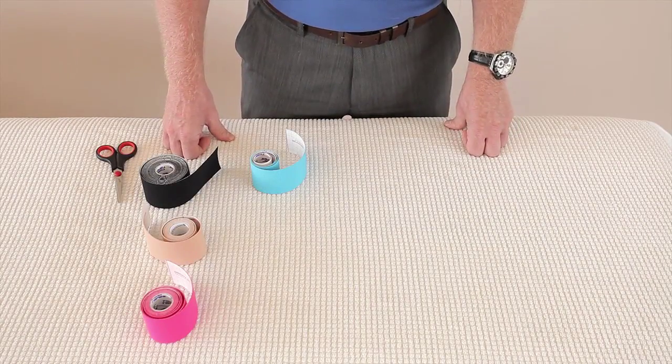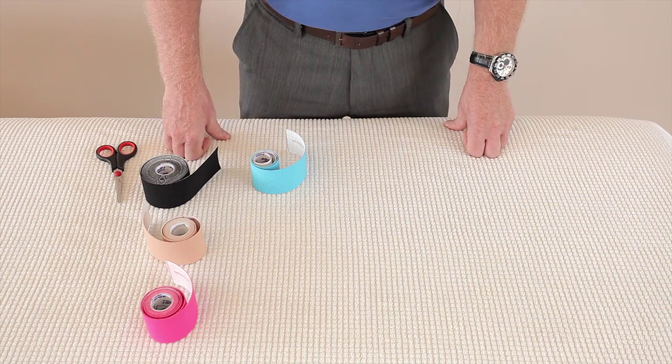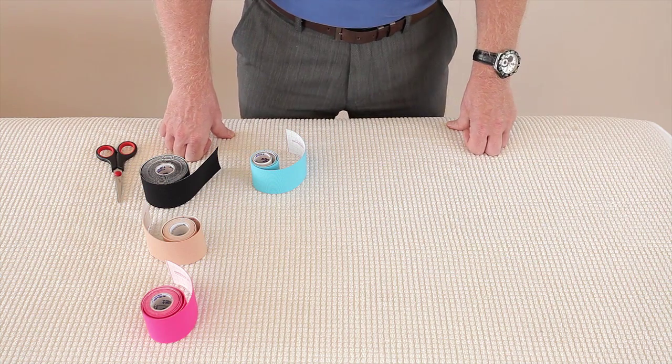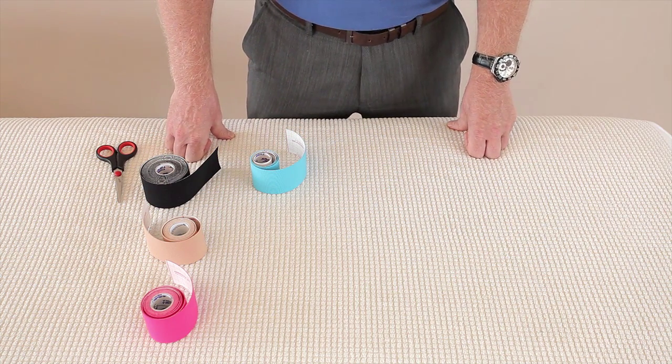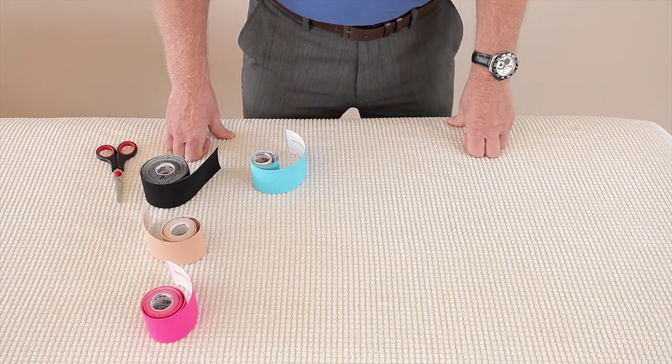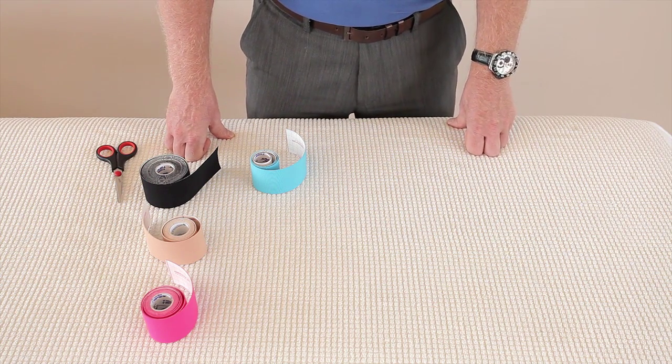We're going to look at pre-cutting the tape for our patient. We can actually buy pre-cut tape, but what I like to do is individualize the tape for each patient, because I look after rowers who are 6'9 and rowers who are 4'9. So I like to individualize the tape for them.